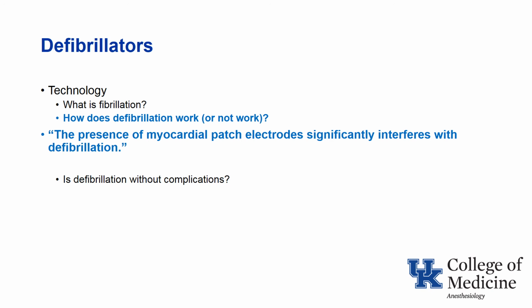So if there is an epicardial patch electrode, it may interfere with the delivery of electrical energy for defibrillation. It may not be very relevant these days, although you may run across a rare patient who has had direct myocardial epicardial patch electrodes attached to his heart for defibrillation.